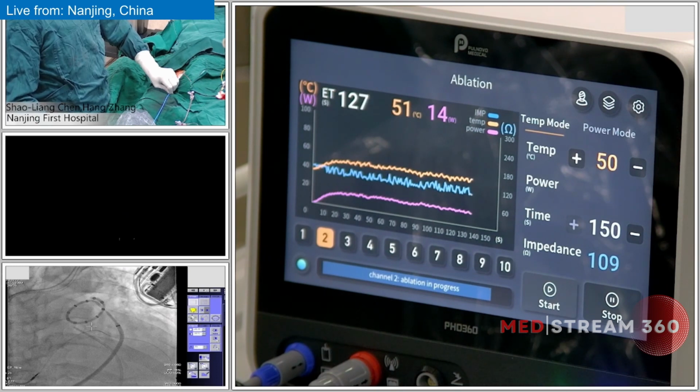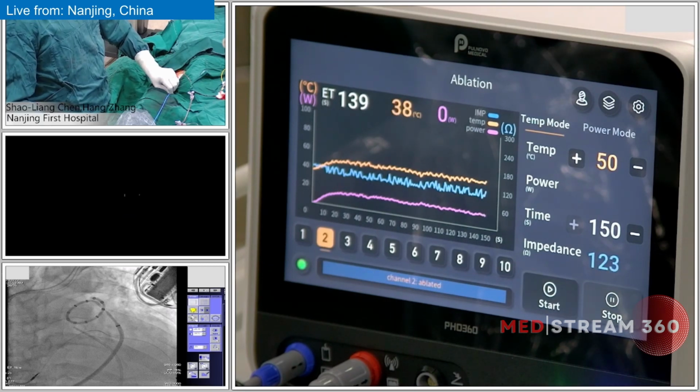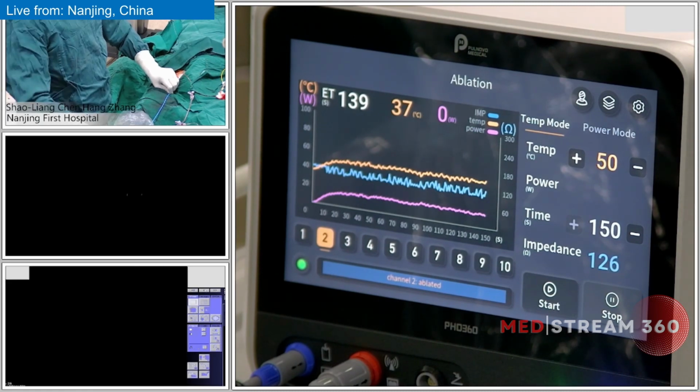Because the patient has combined pre and post-capillary pulmonary hypertension, once we get a slight reduction of pulmonary arterial pressure, I think there will be a slight rebound increase of the PCWP or even... okay, finish it, right? Okay.